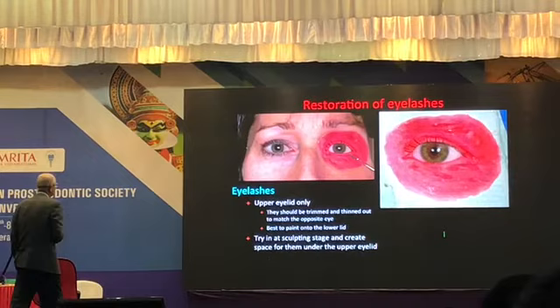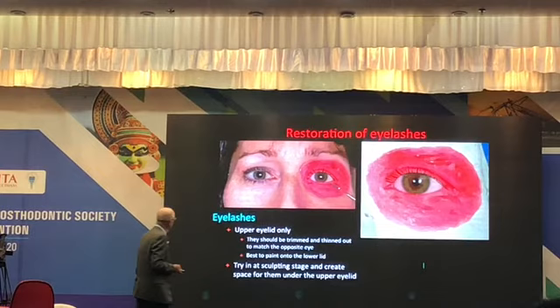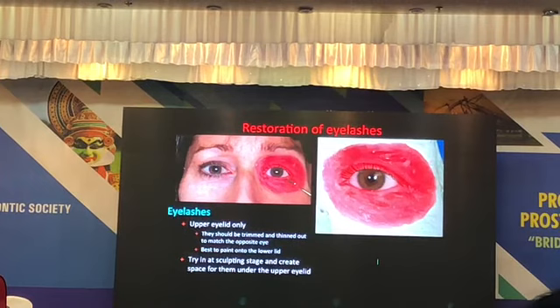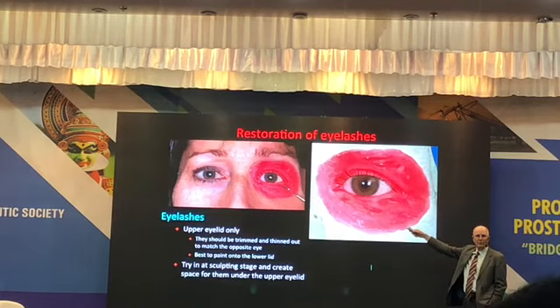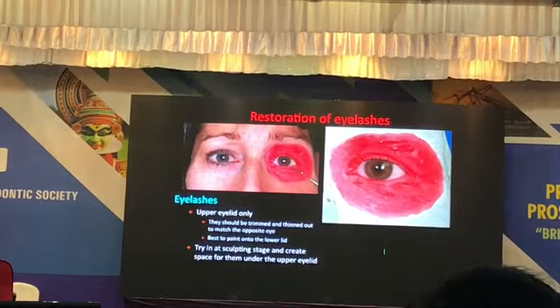Now, I always use synthetic eyelashes for the upper lid, but I always paint them on the lower lid. And you have to be careful about the way you use these eyelashes, because the synthetic eyelashes that the ladies use are very thick and prominent, and they're generally too prominent. So what you have to do is take a scissors and cut away most of the lash to make it look normal, because the fake ones have too much hair. So you have to be careful about that.